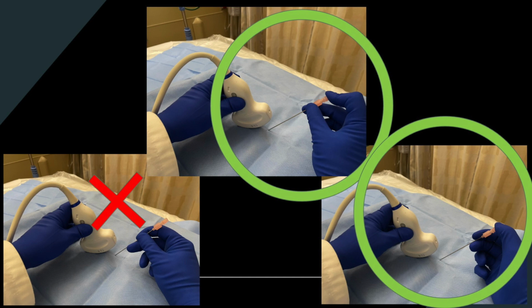So whenever you're holding your needle, try to hold it by the hub, or at the very least, place one finger or your thumb on the hub so that you can actually perceive those differences. Yes, and just another example of the tactile feedback is that when you come to a fascial plane or a capsule, it's a lot easier to just pop it in if you have a finger or a thumb on the hub, or if you're holding the hub. It's a little bit harder to do that when you're holding the needle shaft. And it's interesting how instinctively trainees always want to hold the needle by the shaft. This is a point that really requires emphasis.